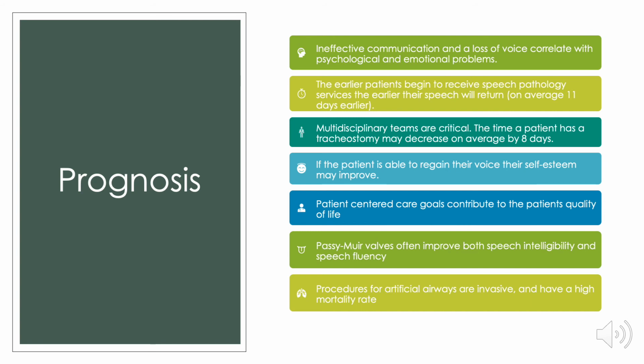However, there are options for a patient to be able to effectively communicate again, such as talking trach tubes, speaking valves, occlusion techniques, and AAC devices. To be a candidate for a speaking valve, the patient has to meet a handful of criteria to ensure they will be successful. Patients on a trach or a vent who want to receive a speaking valve often have an increase in their quality of life because they are less likely to have social and emotional issues.